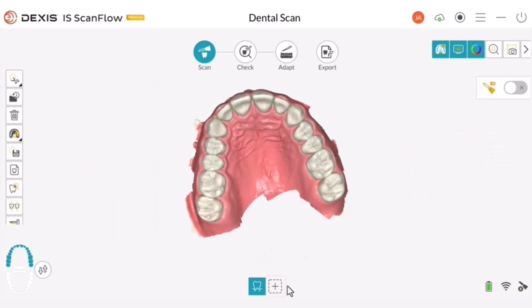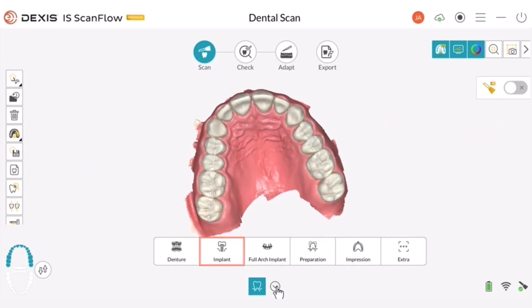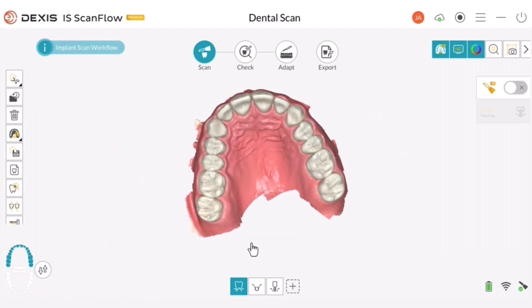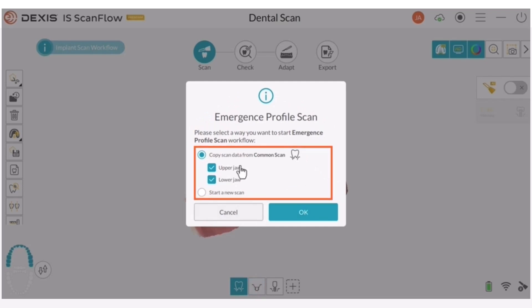Emergence Profile Scan. Click the plus symbol icon to add the implant workflow. Then click Implant. Click OK on the Implant Scan workflow instructions screen. Click the Emergence Profile Scan icon. Select your desired workflow and click OK.